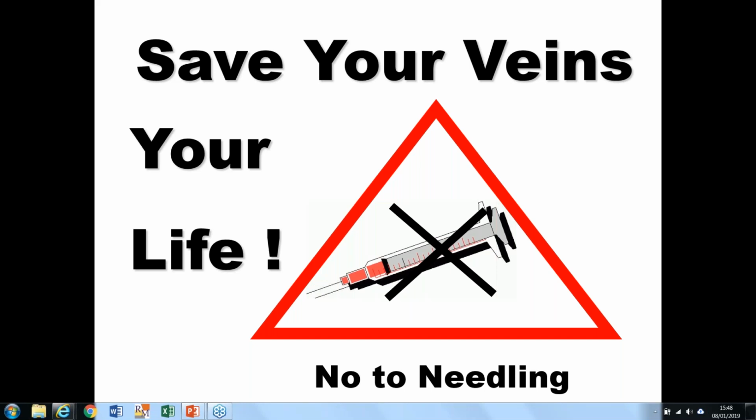That's a very good point. So again, with a gastrostomy insertion, if there's a chance to plan and prepare this carefully, then the best time to do this is before the PD catheter is put in. So the ideal time for a gastrostomy is before, maybe even just 1 week before, but before that PD catheter goes in. If that is not possible and if you're caught in an emergency, there are some centers who do both simultaneously. But I know that there are some recent reports from the US that have shown that it may not be that effective.